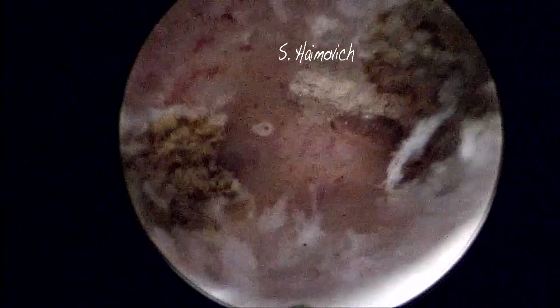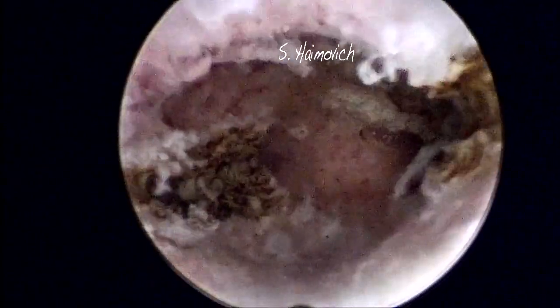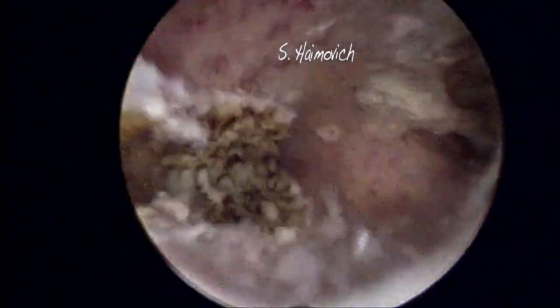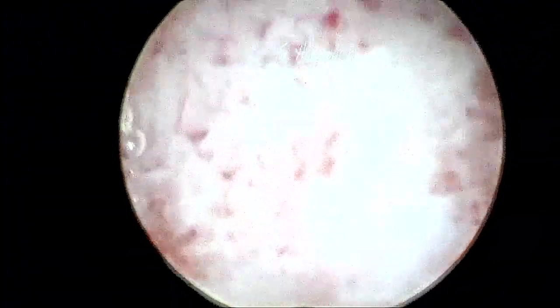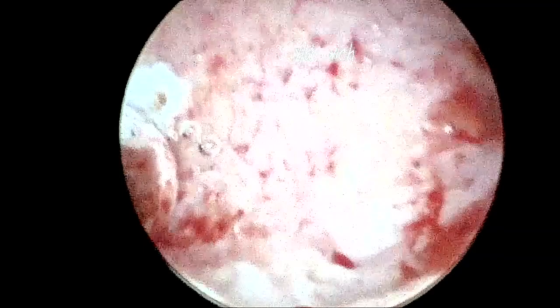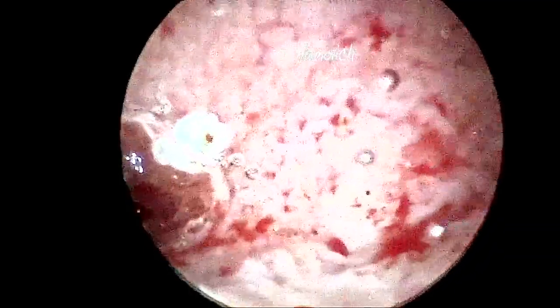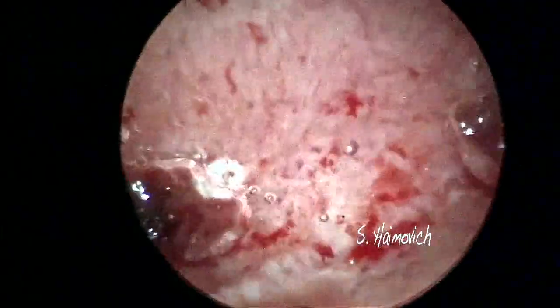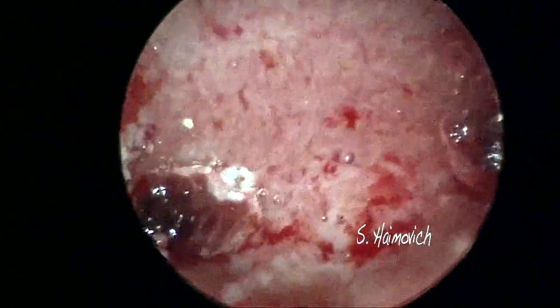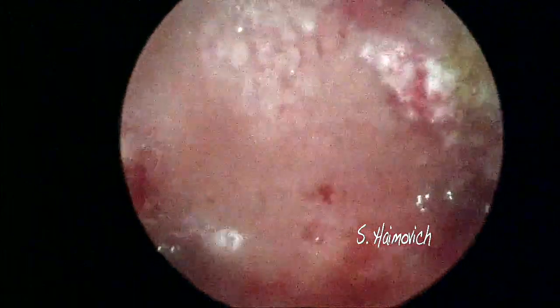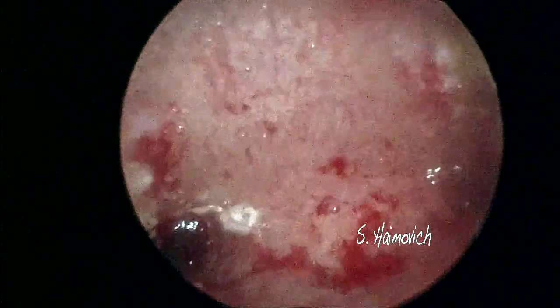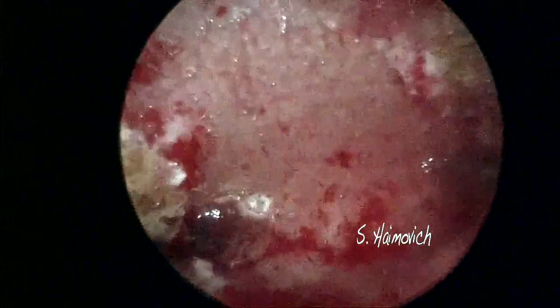When the procedure is finished, in order to avoid any post-surgical adhesion, we inject hyaluronic acid gel into the cavity. We also start a two-month period of hormonal treatment, then we perform a second-look hysteroscopy.